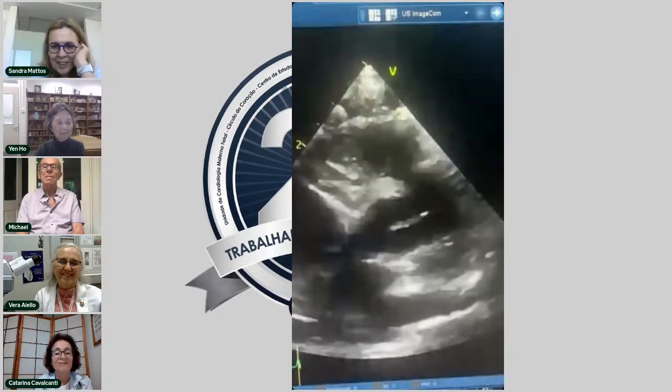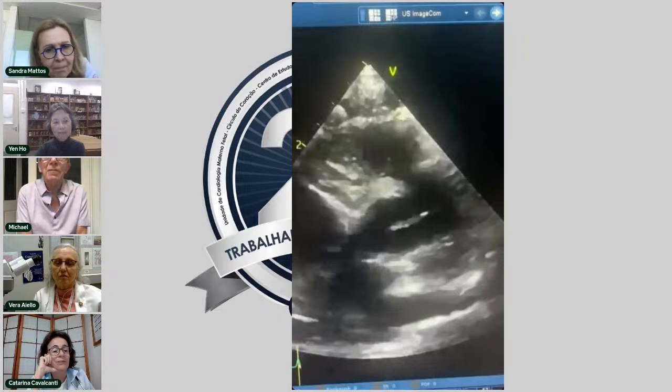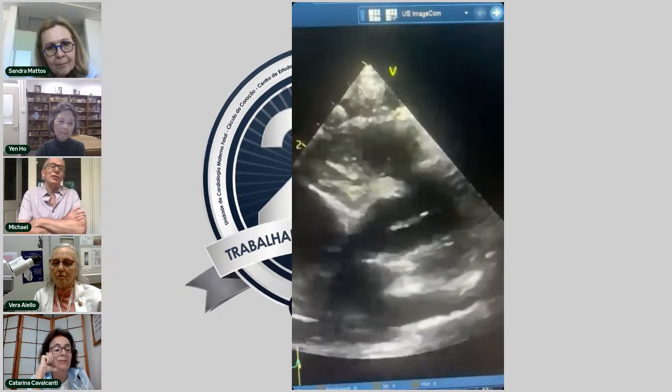Very interesting. So when you said about asking for further exams to look at the coronaries, is this becoming a more routine thing on echoes? Do you basically try to make sure that you have documented the 2 coronary arteries well, and if you have, you don't go further? To be honest, the surgeons have a very low threshold for asking for other investigations these days.